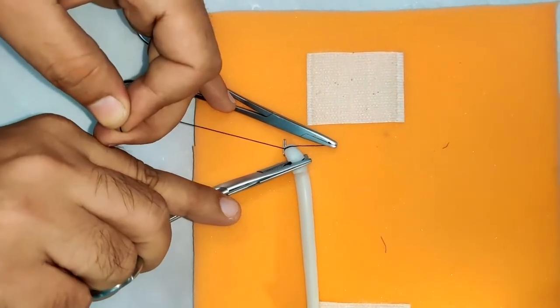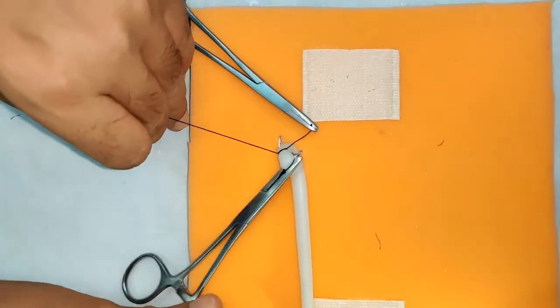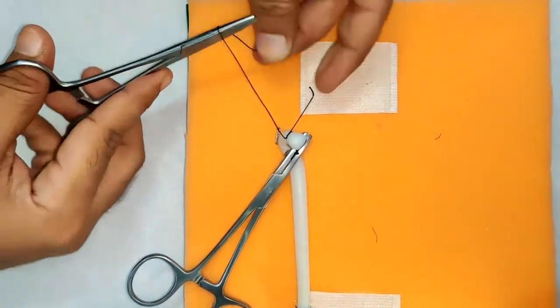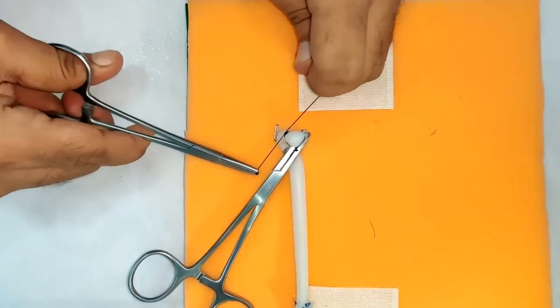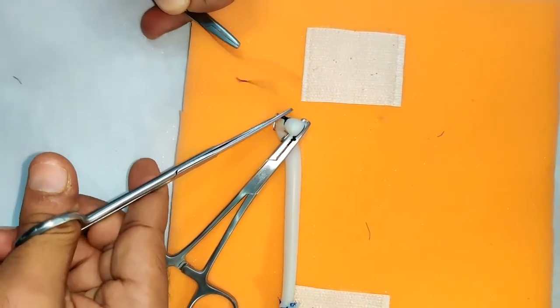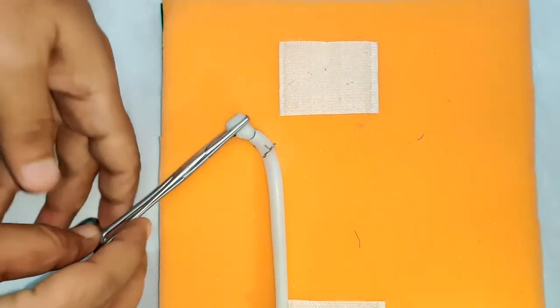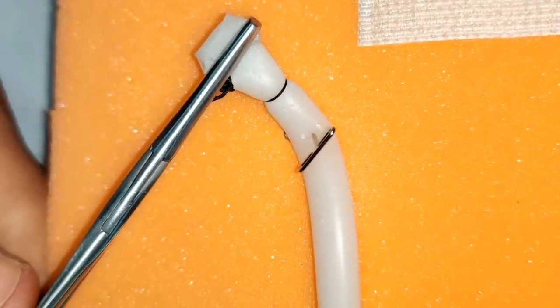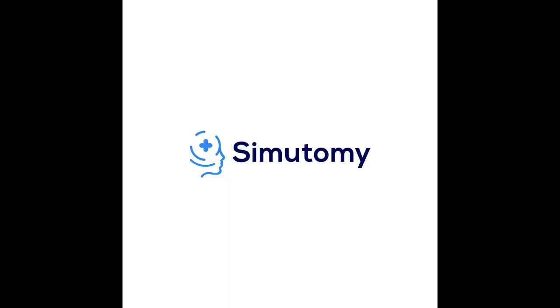At times you need to relax the artery forceps so that the tissue in it is crushed or ligated properly, and you can complete your suture to achieve hemostasis. You can see how the tissue has been crushed, and you can also observe how the tissue looks.